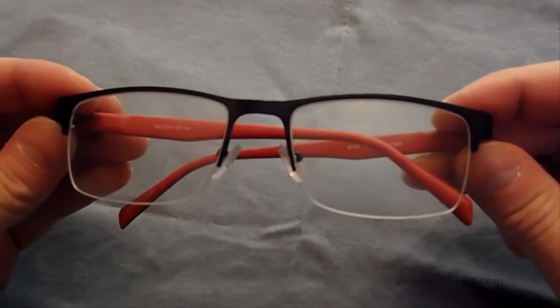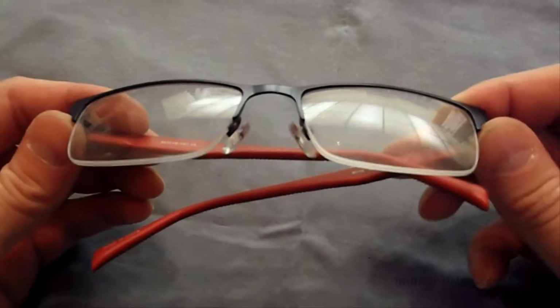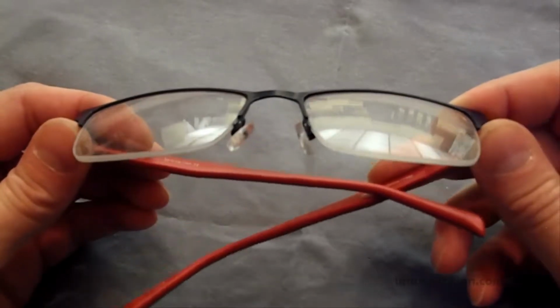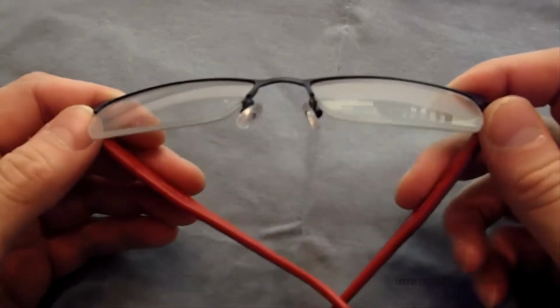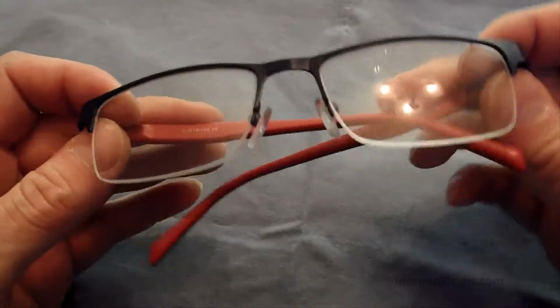It's one of the things that a lot of my new opticians struggle with. They find it intimidating. They have a hard time figuring out how to do it. And it's really quite easy once you know the easy way to do it. And here's the easy way.